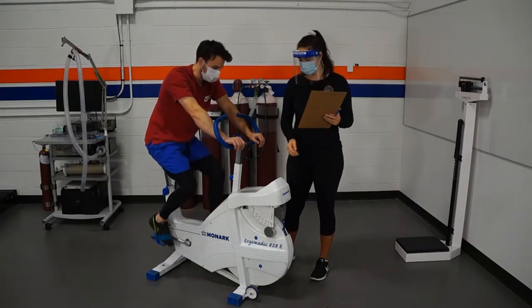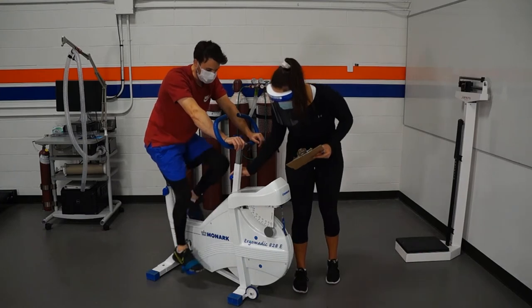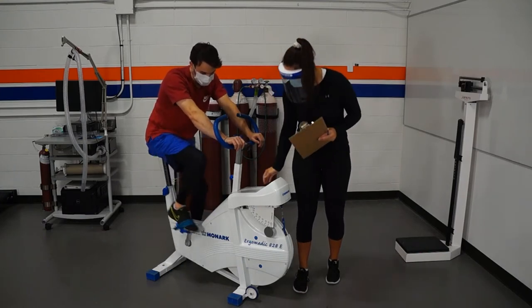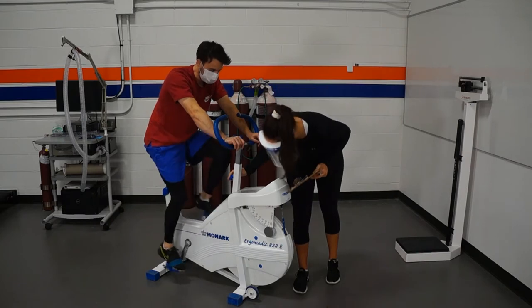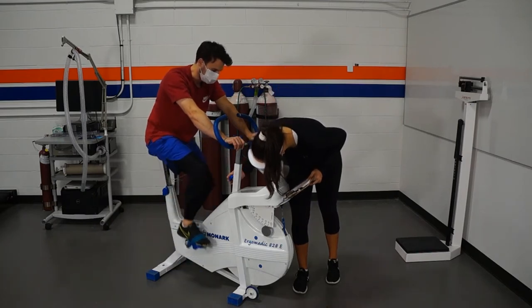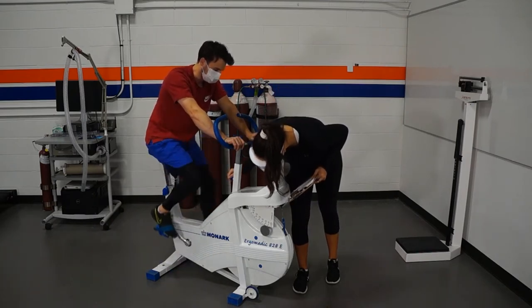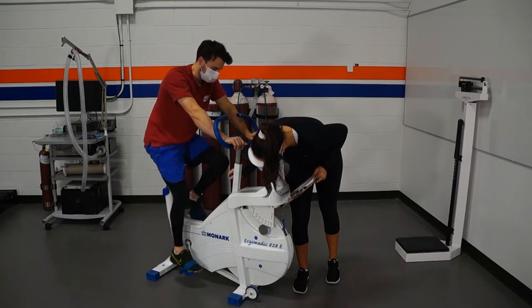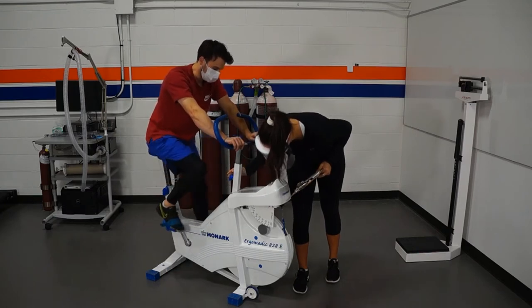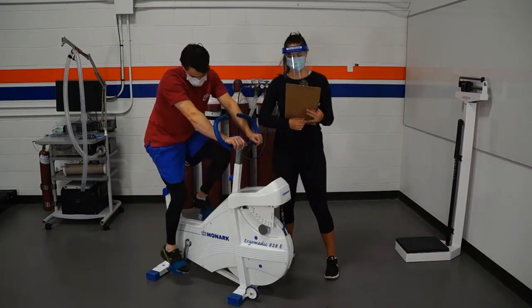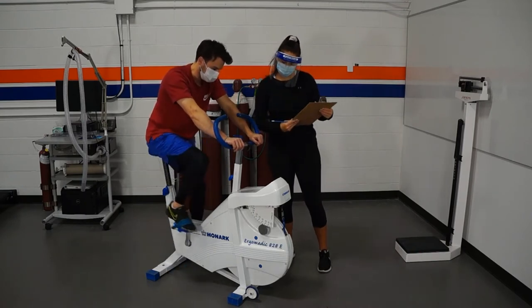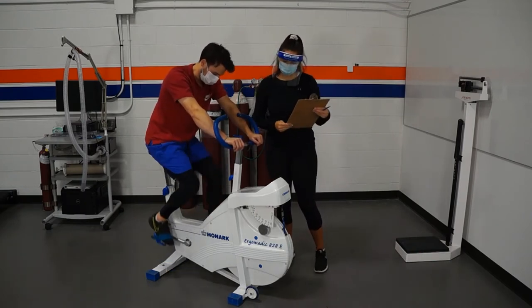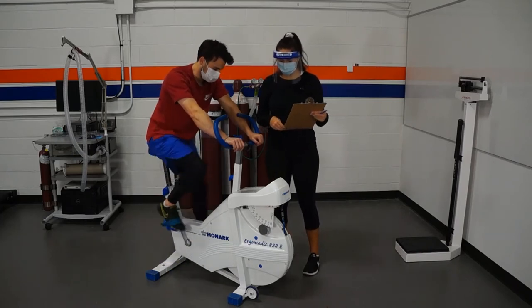We'll then increase the workload to the appropriate 2 kp, which corresponds to what we just marked out on the chart. Again, ensuring the participant maintains the cadence of 50 rpm, you can proceed through this workload, again taking heart rate every one minute and taking RPE at the end of the test.